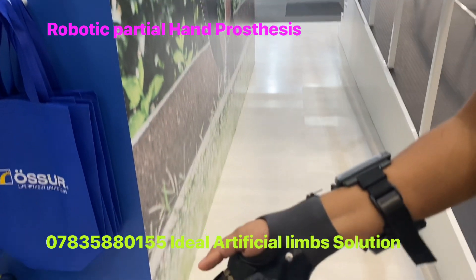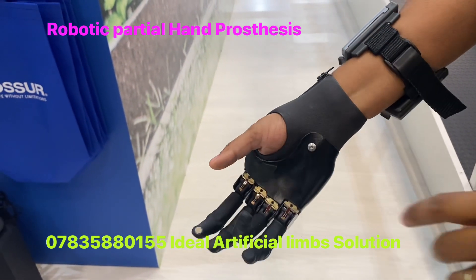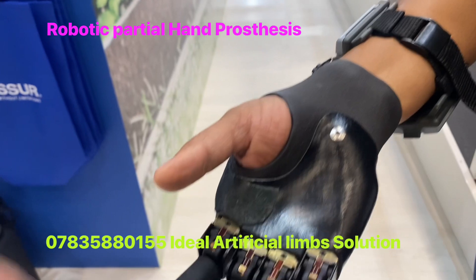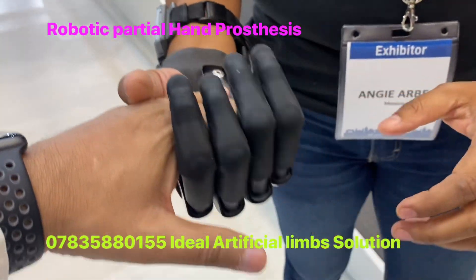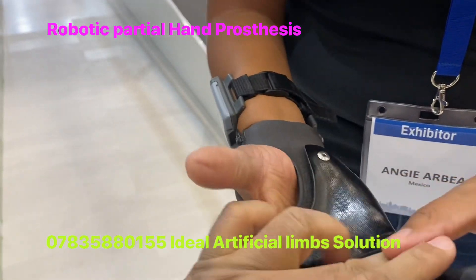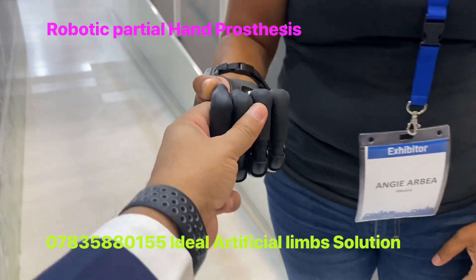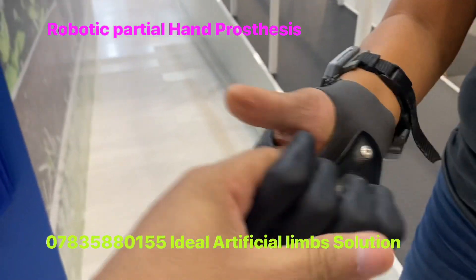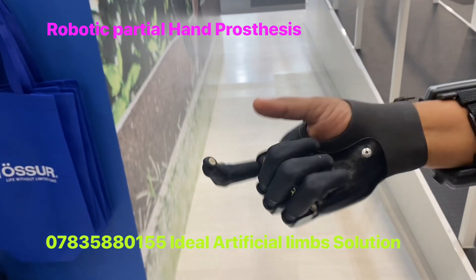Let me show you this. Put your finger here and pull it. It has very good strength — the finger is not coming out. Very good strength.